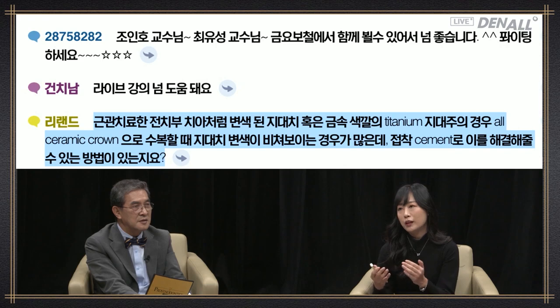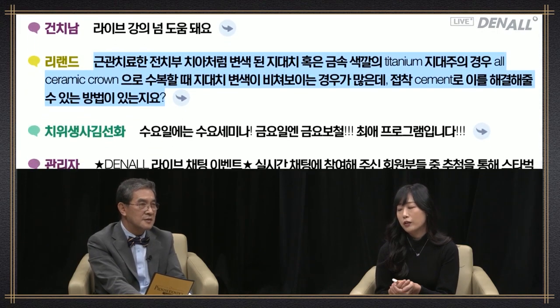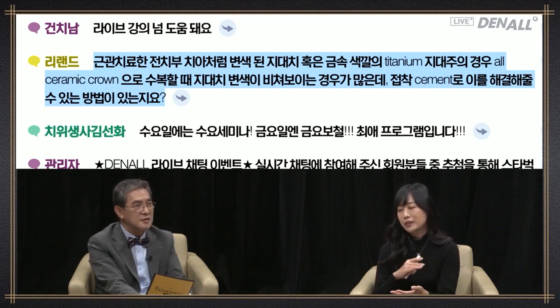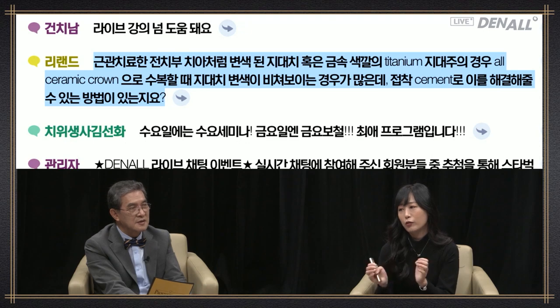Before restoration is done, if you cannot adjust it using bleaching or if bleaching is not an option, and if the restoration is all ceramic crown, it is very difficult to block out discoloration. Therefore, using opaque crown is better. PFM or PFG should be used with opaque so that margin is not shown. Or else, the discoloration may show through soft tissue.